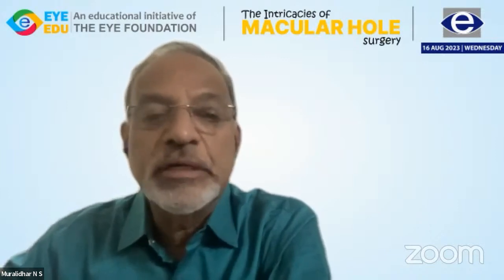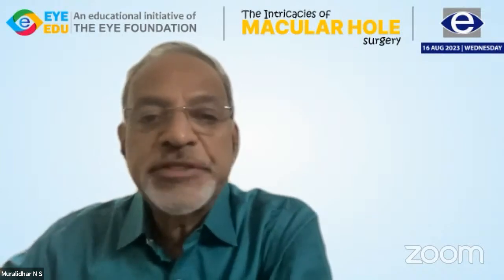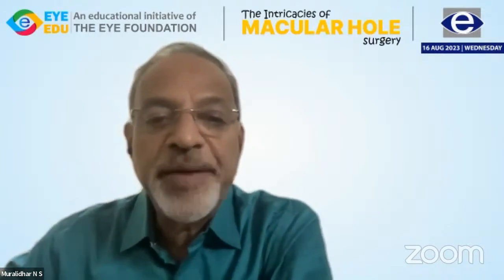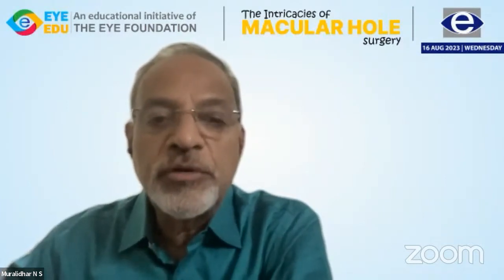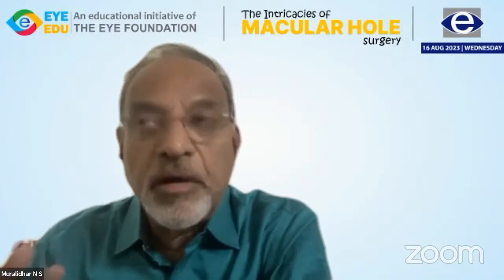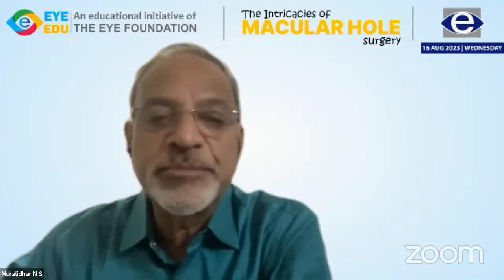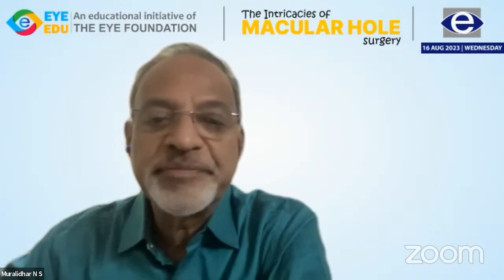I never use a gas, even SF6 or C3F8. I'm just interested to know what the other panelists do in their practice when there is an ERM, no macular hole, or even a lamellar macular hole, no full thickness macular hole. What would they use? I would just use air.